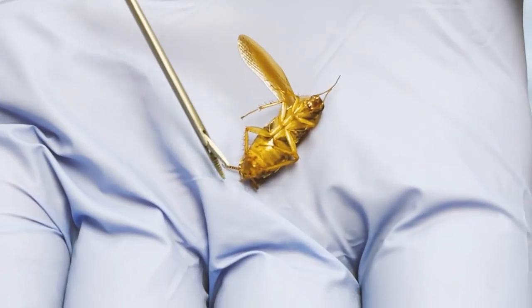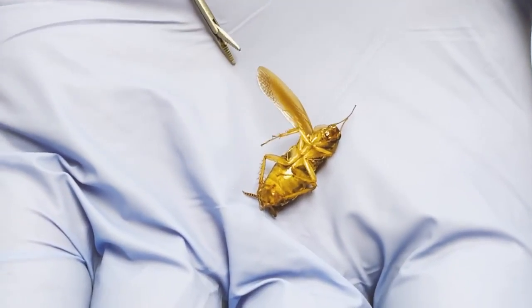I'm seeing a little bit of movement of the extremities. There we go. See that?